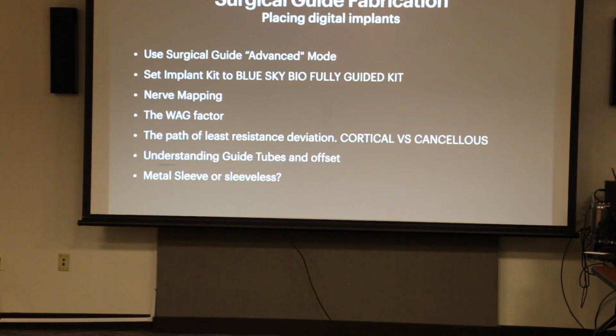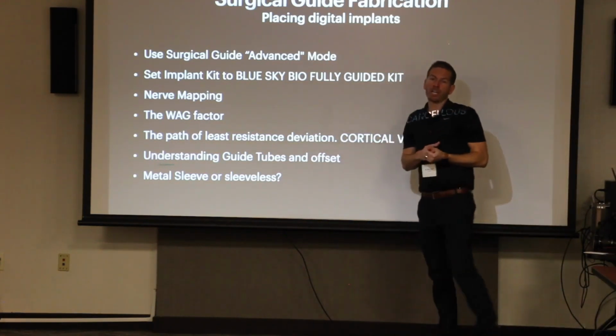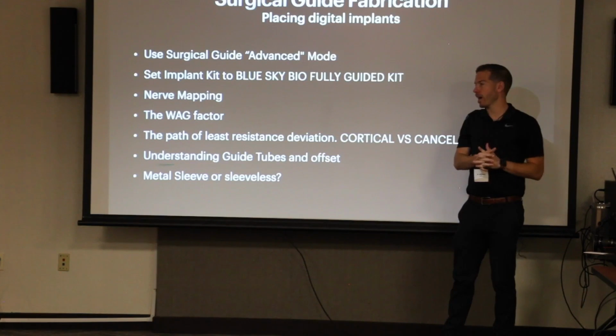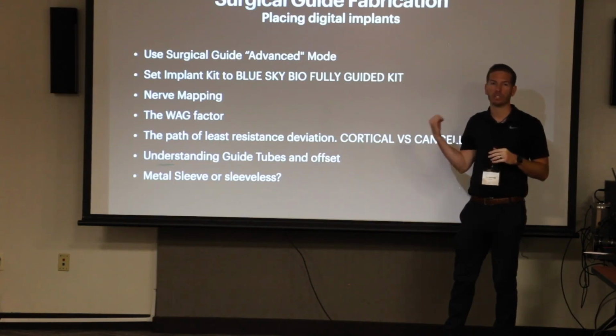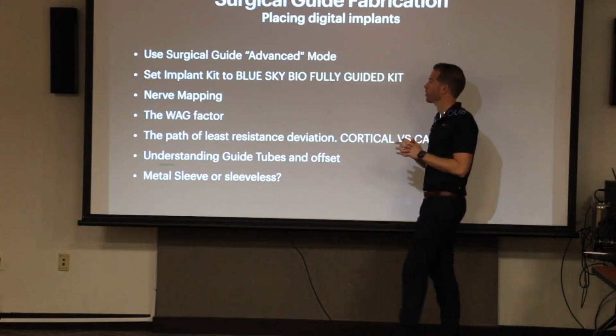We still have to go a little bit more theory here before we jump into the computer, but I'm going to try to get through this to understand the nuances of the surgical guide, and then we're going to try to get onto the computer, and I'm going to walk through. We're going to design that surgical guide start to finish, bring in the files and create it.